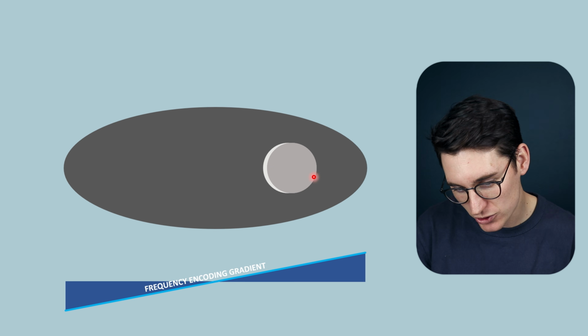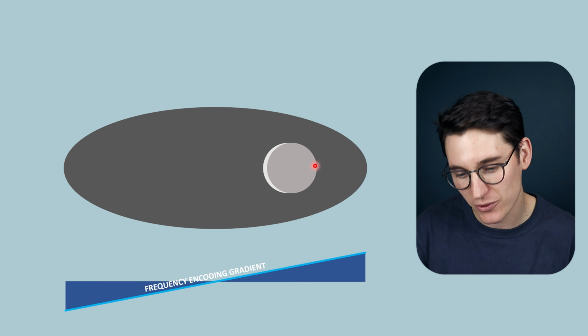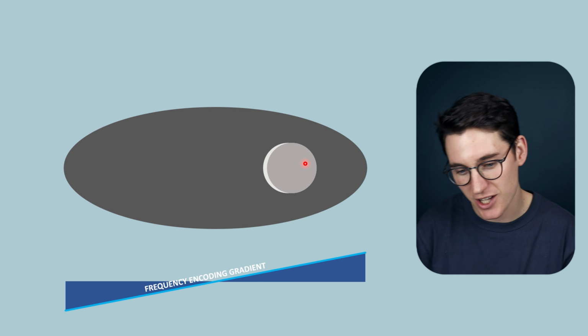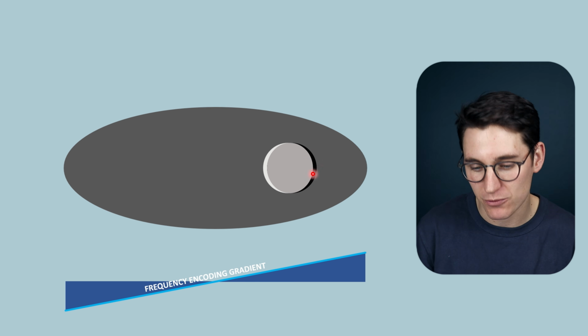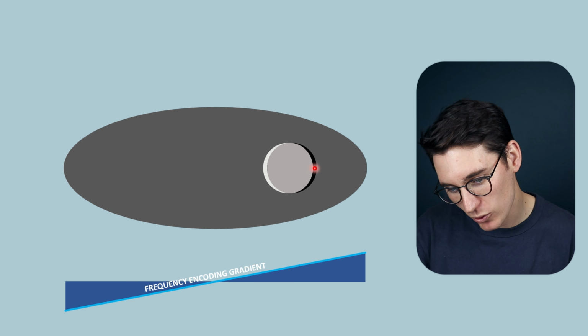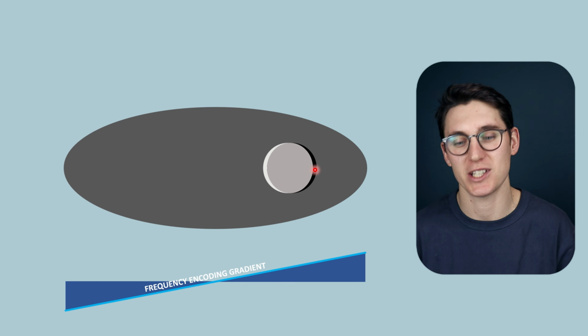Now the opposite is also true. The fat here is going to precess at a slightly lower frequency than the surrounding water, and it's going to be misregistered along the x-axis this way. Now we get a dark band forming on this part of the fat, because there's no underlying water here spinning at this frequency for this x-axis location, it's giving us no signal.